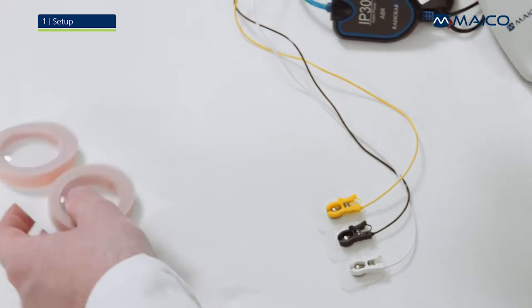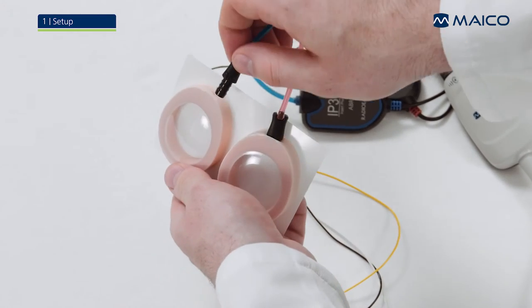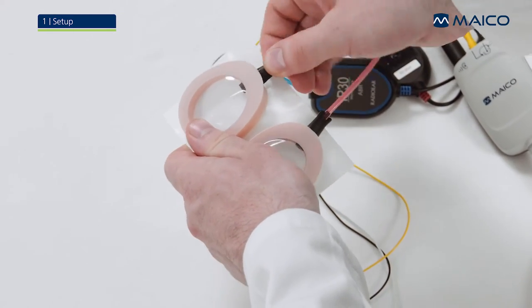Connect the red and blue tubing of the insert phones to the ear cups. Simply push the ear cup adapter of the insert phones into the prepared socket in the form of the ear cups.